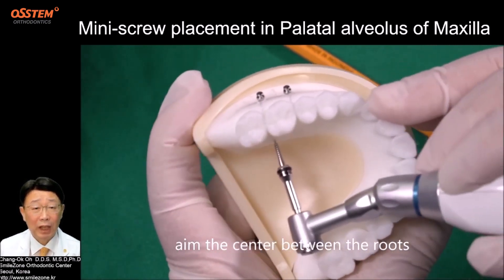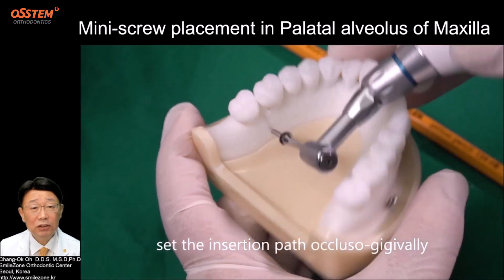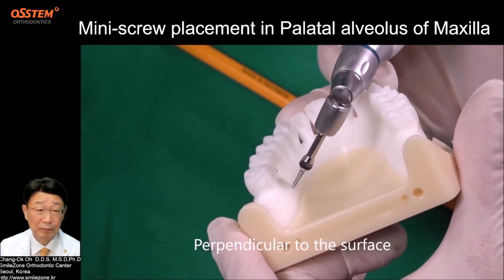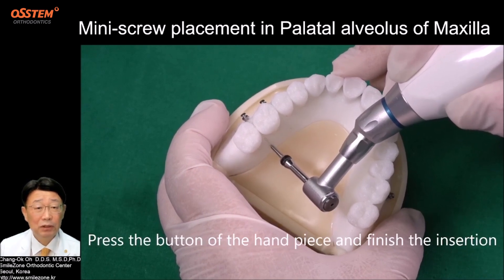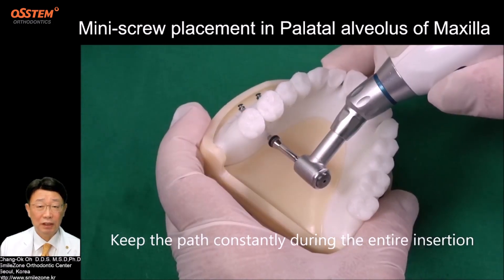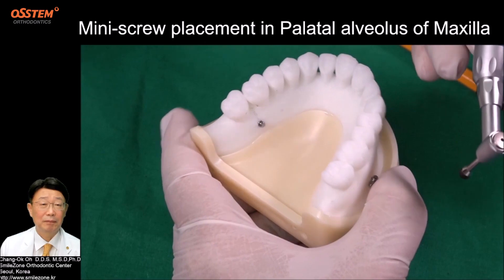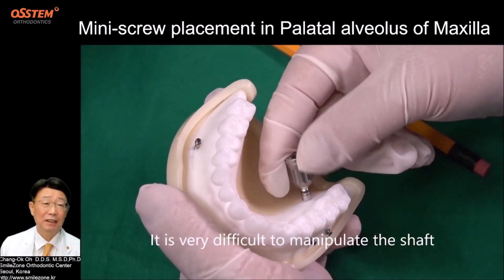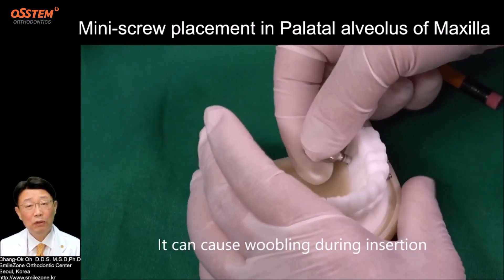Step 6: Set the insertion path. Aim the center between the roots and check from multiple directions with the dental mirror. Set the insertion path occluso-gingivally, perpendicular to the surface. Step 7: Finish the insertion. Once you set up the path, press the button of the handpiece and finish the insertion. Keep the path constantly during the entire insertion. Using a small manual handle at the palatal site, it is very difficult to manipulate the shaft and maintain the path straight, which can cause wobbling during insertion.